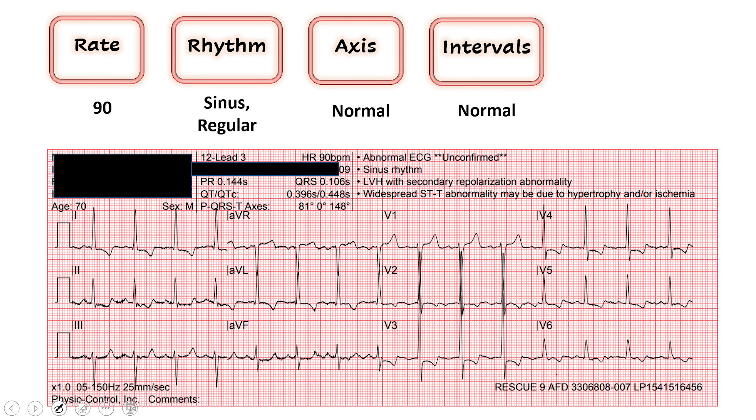Next we move on to intervals. We look at our QRS to see if it's wide or narrow. A wide QRS is defined as greater than 120 milliseconds. Ours is 106, so narrow complex — that's good. And then our QTc is another very important interval. We want that to be less than 450. Remember, if it's greater than 500 our patient is at risk for spontaneous arrhythmias. Both of these look good in terms of intervals.